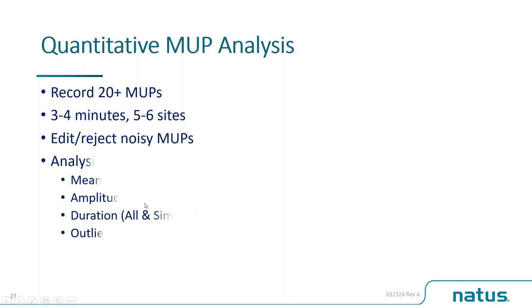And we can do the analysis of mean amplitude, mean duration, and we can do it using all potentials or simple potentials. And we can also look at the outliers. Now, what I'm going to do is demonstrate to you that we can collect motor unit potentials in a very short period of time. So here we go.